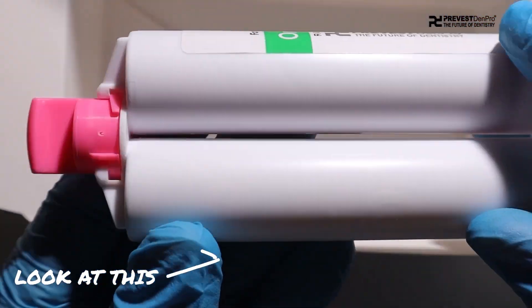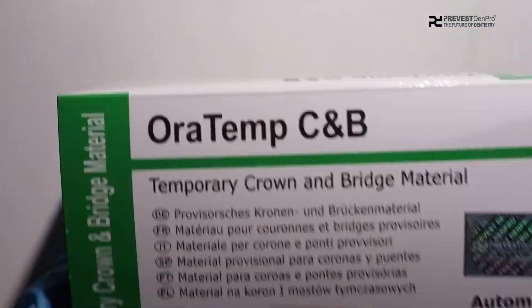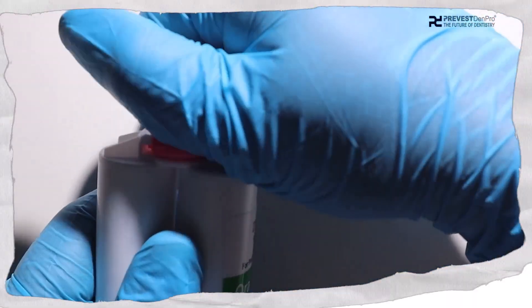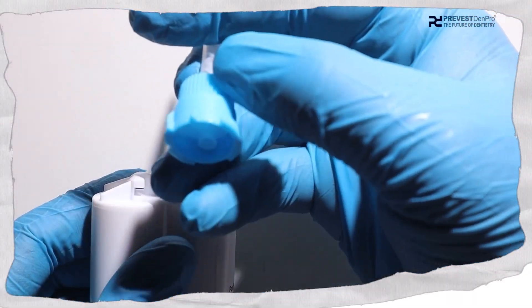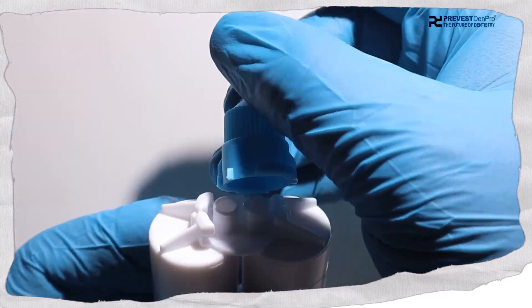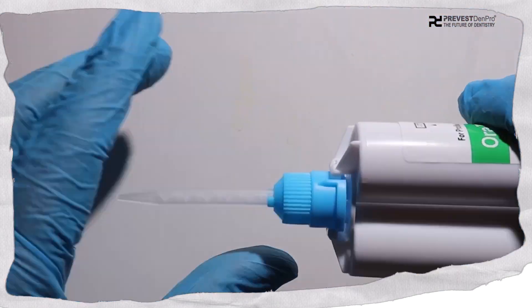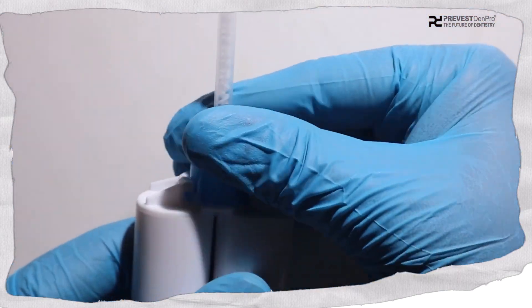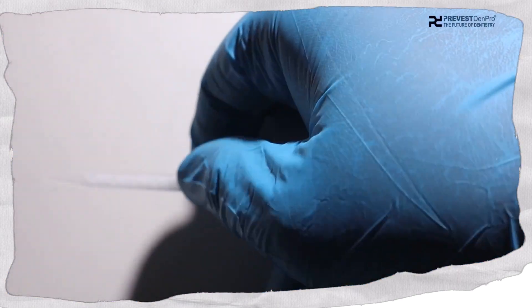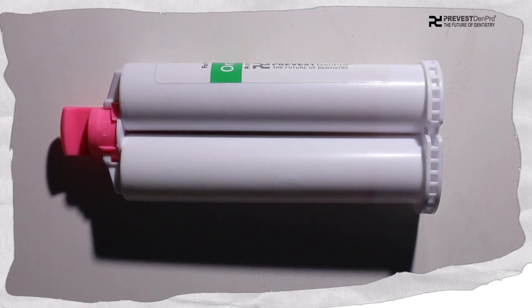Let us see how to assemble the kit. We need to remove the cap and then apply the applicator tip onto the cartridge. We select the notch, place it accordingly, and rotate it. After using the product, we should dismantle the used tip and reapply the cap so that the material doesn't get dried up.